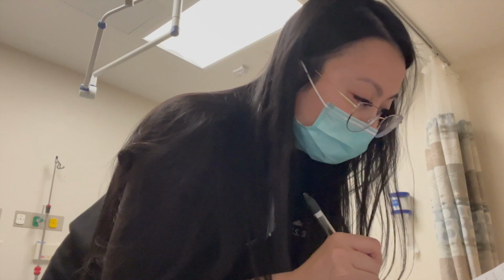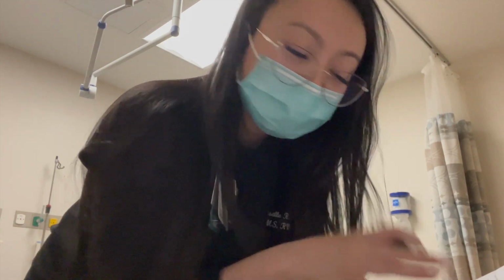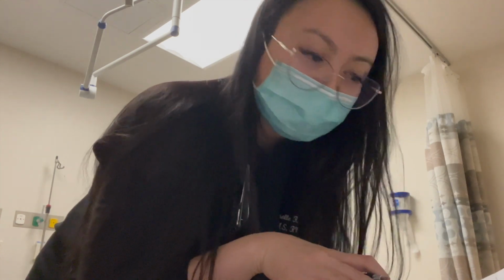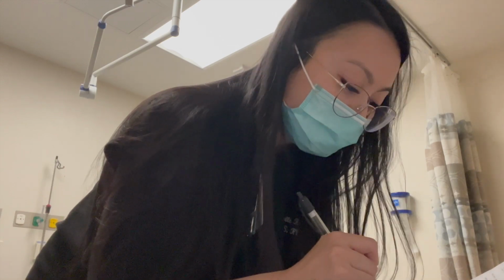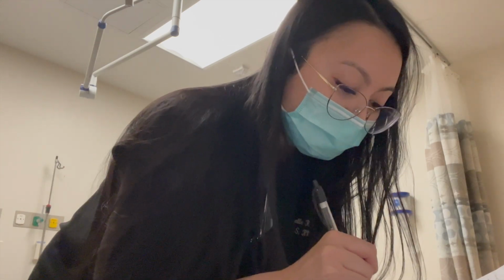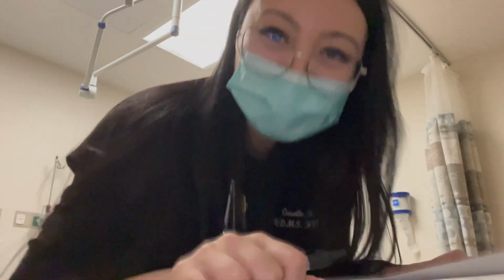Basically what I'm doing is writing the information on the probes that I used and the patient's info in this book for quality assurance, just in case anything happens, we have it logged in our book. All right, on to the next patient.